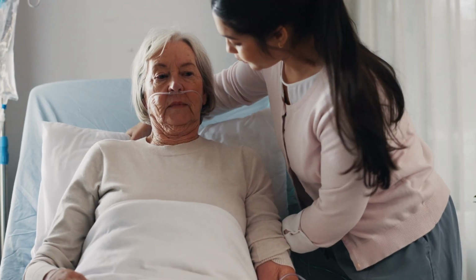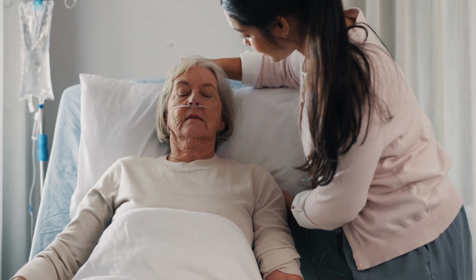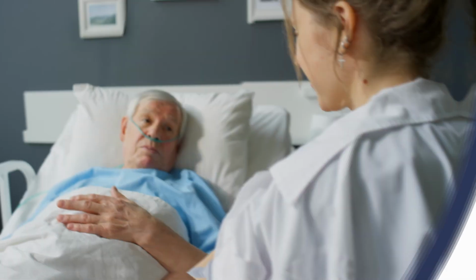There will, however, be times when alternating needs to be paused. This feature comes in handy, for example, when you're doing wound care or giving a bed bath, your patient is eating a meal or getting in or out of bed. That's when you push the static button.